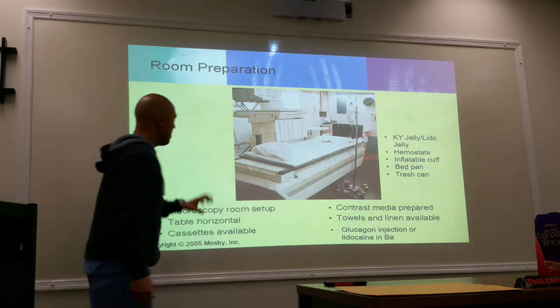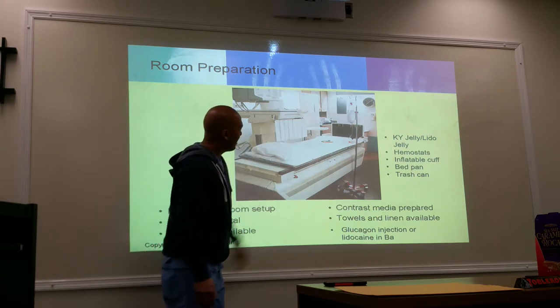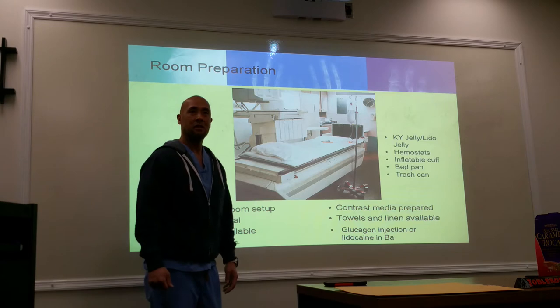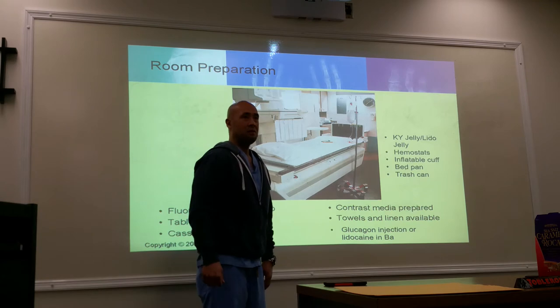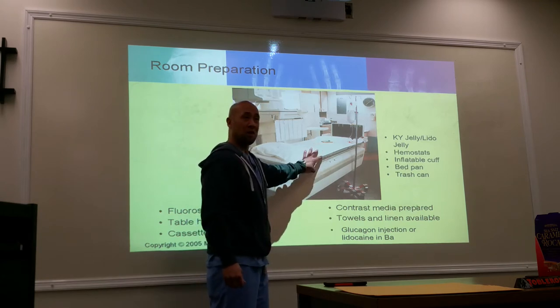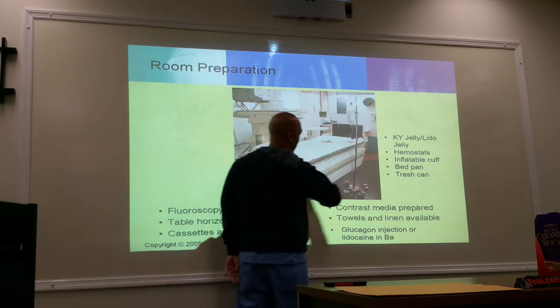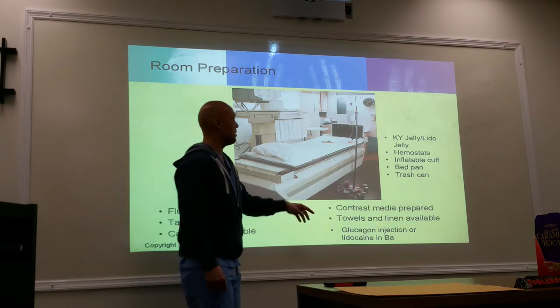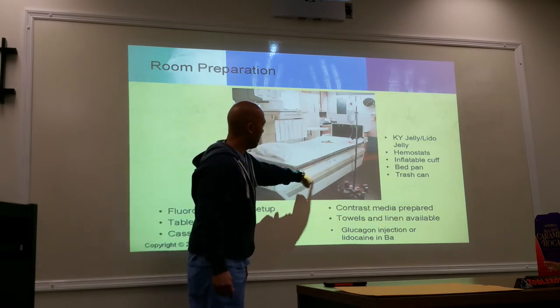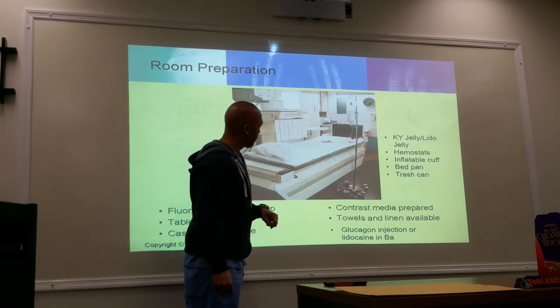Make sure that your fluoroscopy unit works and you've got your lead curtain intact. What are you going to do with the bucky? Move it to the end. It's going to go all the way down to the end. Don't leave it in the middle, because when you're doing fluoroscopy and the bucky's still there, it's going to produce a lot of scattered radiation, and now you just blasted your gonads. So make sure that the bucky mechanism is all the way down at the foot of the table. Where's the x-ray unit for fluoroscopy? Underneath, under here. What is this? Image intensifier. Okay, good.